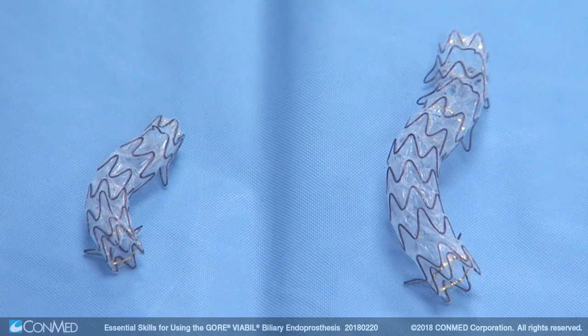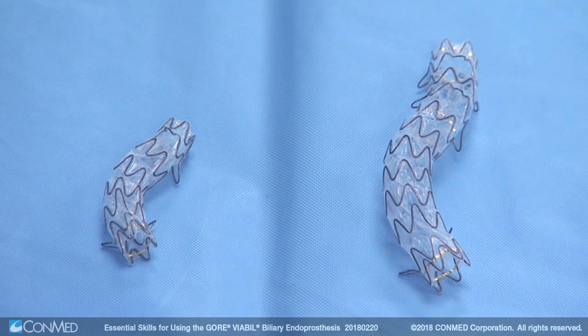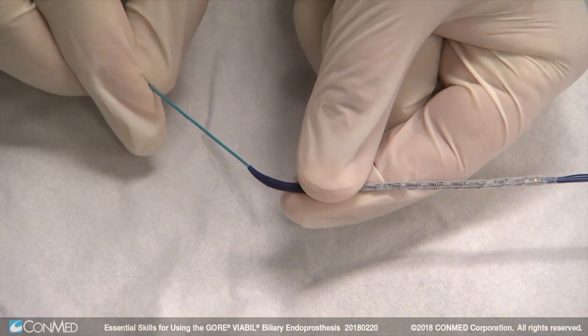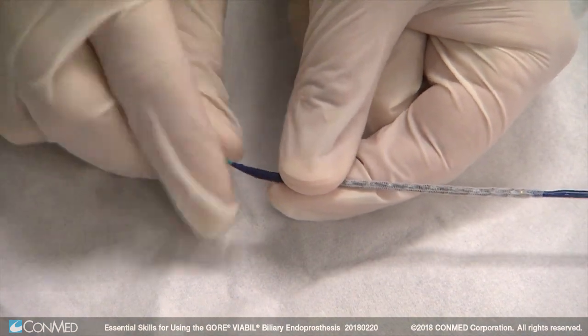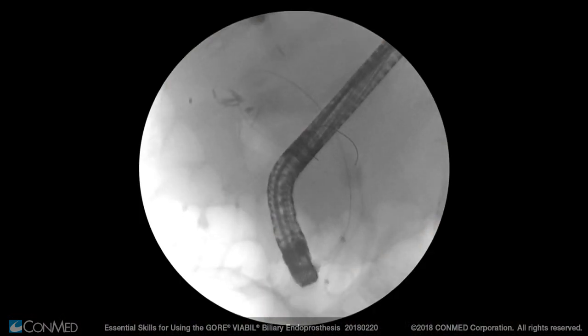Both versions feature a non-foreshortening stent design, allowing for optimal and accurate deployment positioning. The curved taper distal tip allows for the catheter to easily pass tight strictures while backloading over the guide wire.